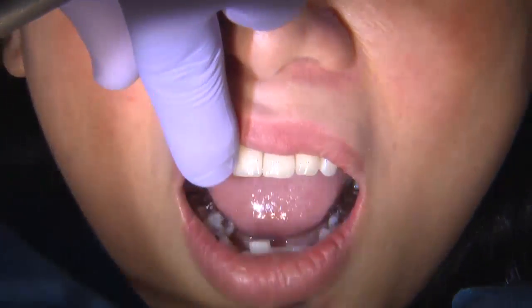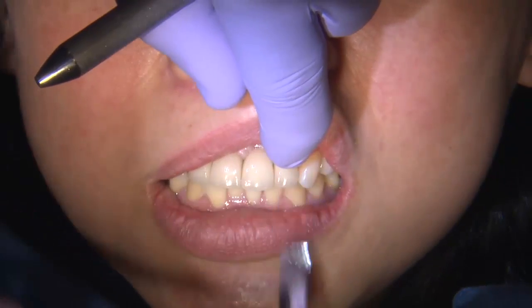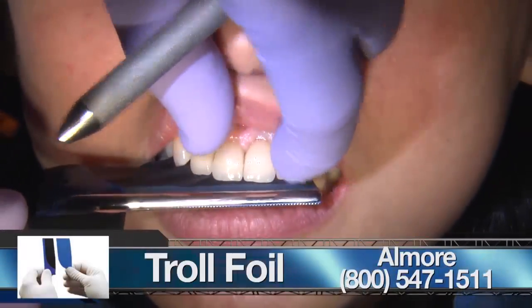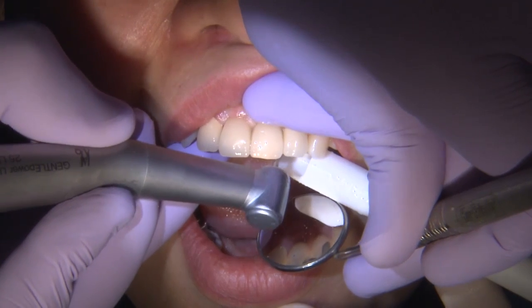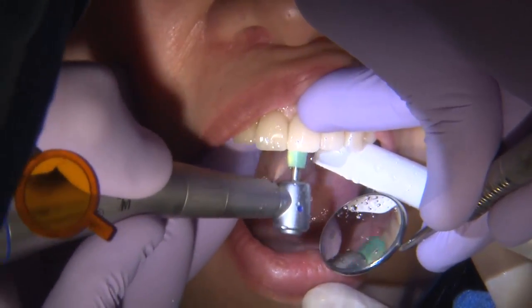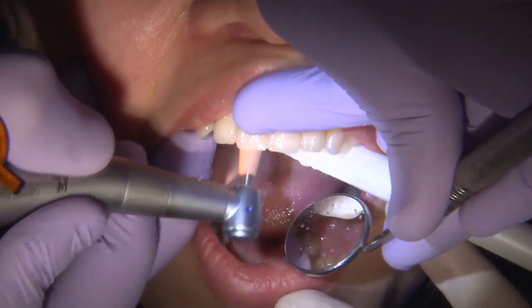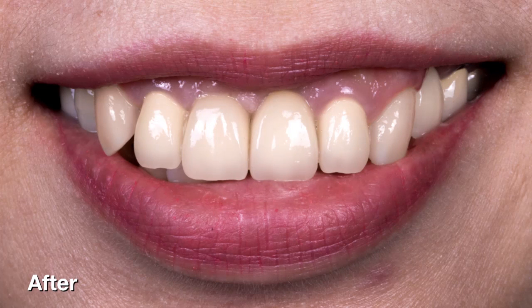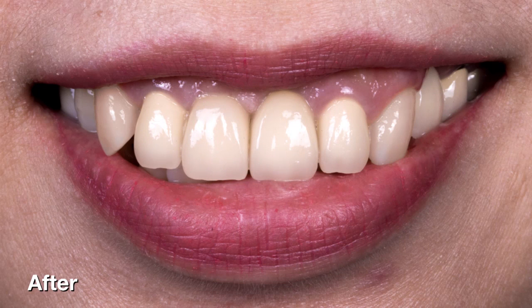We checked the occlusion, making sure that on the implant restorations especially, the shim stock is passing through. I noticed the shim stock was catching on the centrals, so I checked with articulating paper and made any necessary adjustments, then polished the porcelain. I took the patient through the entire protocol of making sure that not only do these fit and look nice, but also that functionally and in terms of occlusion, the patient is comfortable. Here you see the final result of the Obsidian to metal restorations — beautiful, blending very well with the soft tissue and gingiva, creating nice aesthetics with soft tissue peaks and the overlying porcelain of the Obsidian to metal crowns.